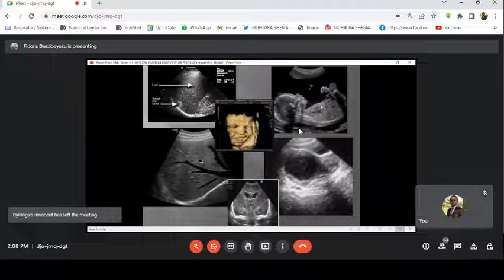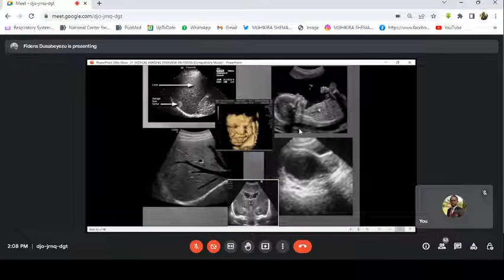On real-time examination, you can see even the heart beating, and you can measure the heart rate. You can see the hand. Can you see 1, 2, 3, 4, 5 fingers? Very well. Even this is the leg. So ultrasound can show you that the dark one is fluid in the uterus. Fluid is anechoic. You see? That's a very good procedure.